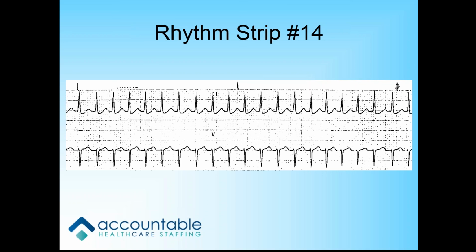So let me give you a scenario. We're going to play around with this one a little bit. So this would never work on your oncology unit, but pretend this happens anyhow, okay? We never really get this stuff. But let's pretend you're in the ER, and I am 22 years old. I'm a college student. It is end of quarter exams, and I've been up all night studying like crazy and drinking lots and lots of Red Bull because I have not studied enough. And I walk in and I tell you I've been feeling palpitations and a little lightheaded, and you hook me up to the monitor, and this is the rhythm you get. Okay, so we're putting it under SVT because it's so fast. What are some of the things you could do for me?